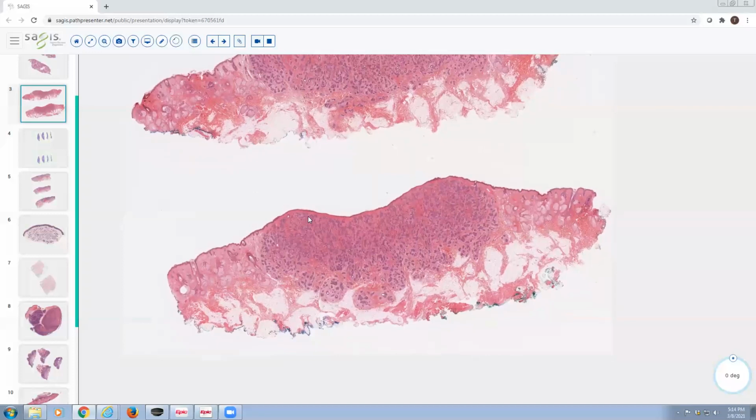So what you're seeing here is an excision. And just to orient you on the size, you've got your sebaceous lobules and your hair follicles here. And then this tumor extends into the subcutis, and you've got this broad span here. So this is large, but otherwise well circumscribed and symmetric. So it has a benign silhouette, but recognizing that it's on the large size.